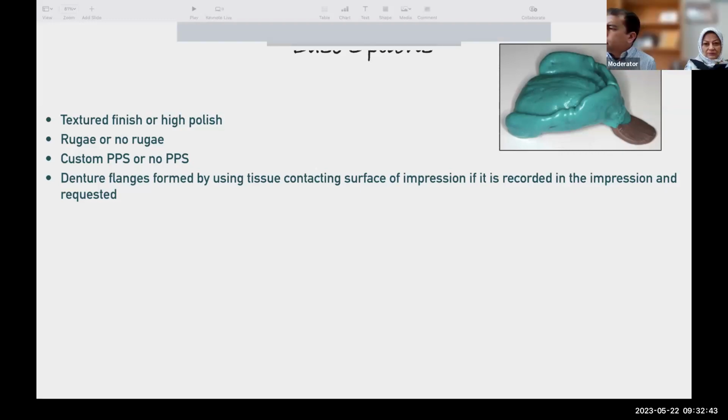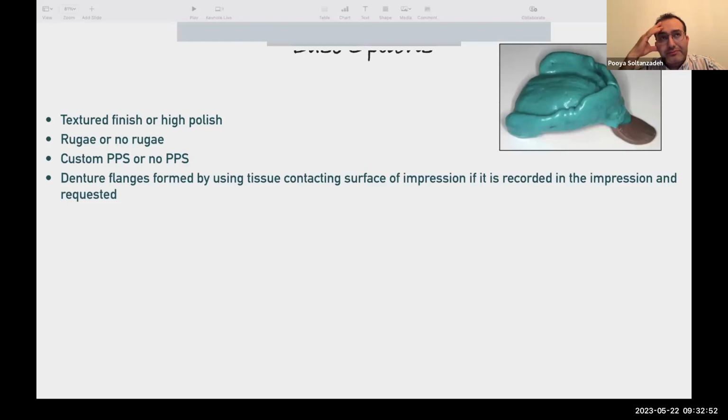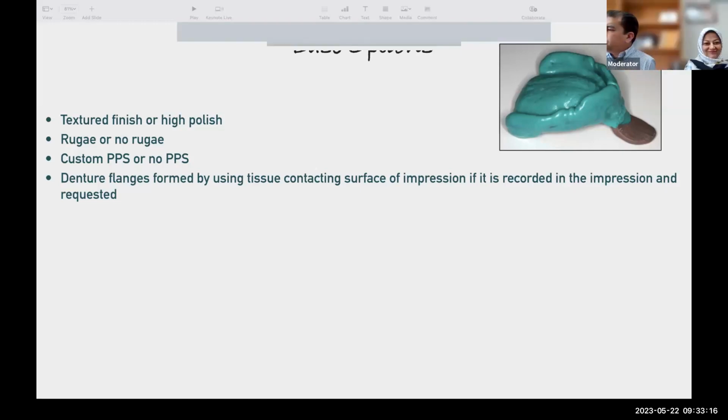In the palate area, sometimes it's literally see-through, and you can go sometimes half a mil. I just delivered 2 dentures, basically a kind of partial denture. I actually have the case toward the end, and the thickness was almost half a mil, and it was very thin, which I was a little afraid about because of fractures. So what I did, I just roughened it up and thickened it up with a cold cure resin, to make sure the patient will not break it. I'll show you that case actually. All right. Thank you.